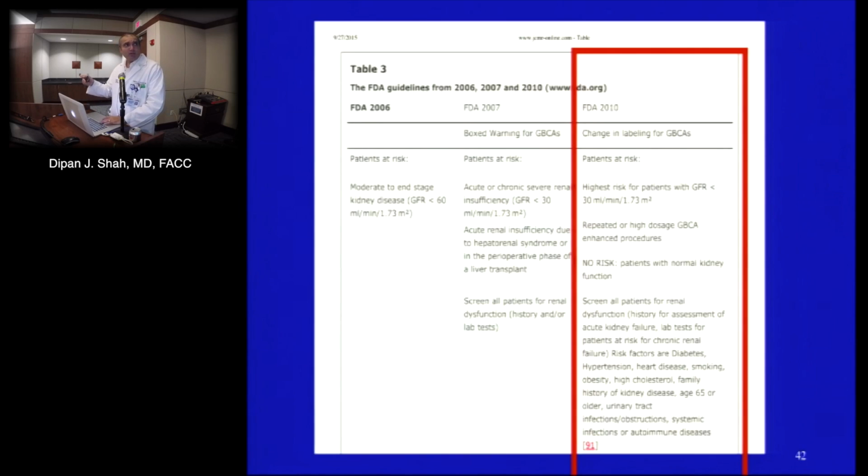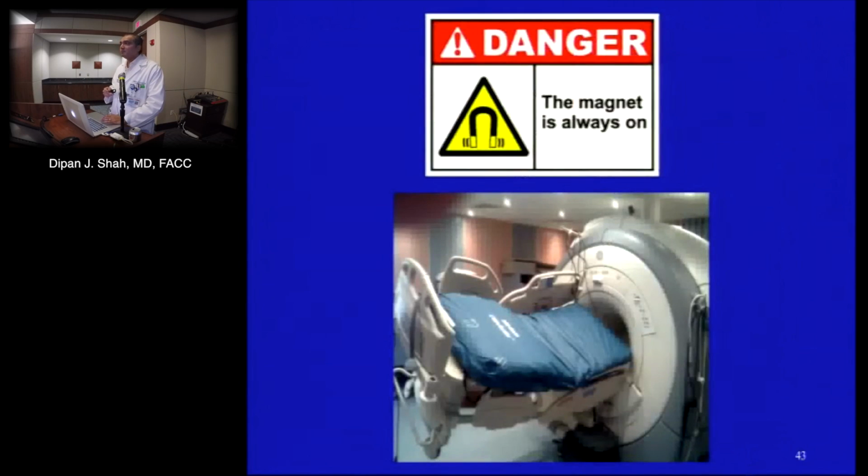Now, the last thing I want to touch on is the issue of safety, okay? I was going to put this at the beginning of the lecture, but I'm going to put this at the end because I want people to go home with this message more than anything else, which is two things. The scanner's always on, so there's no such thing as, okay, I'm going to go in at nighttime, the lights are out, I can just go into the room. No, the scanner's always on, and if you take anything that's metallic, ferromagnetic, into the room, it actually can get attracted to the scanner, okay?